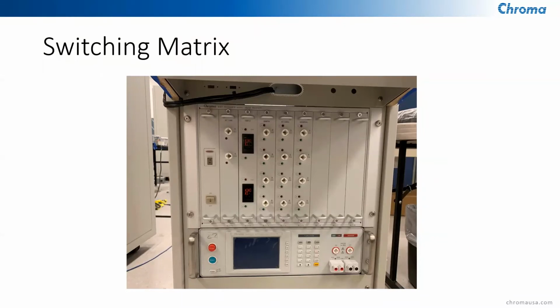So here is a close-up of what the scanner looks like. I always like to include a few pictures in these PowerPoints. That way we can kind of see what we're actually talking about instead of just continuing to read words. So you'll see the outputs there, and this is kind of where all of the switching occurs, which really is the value of having the system, especially once you get into the complex multi-point applications.